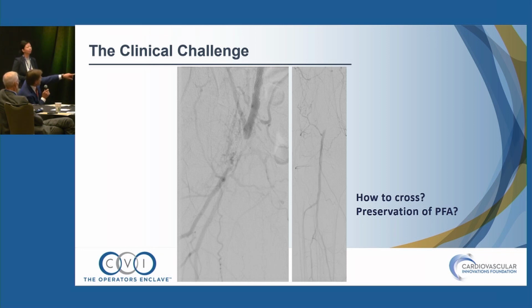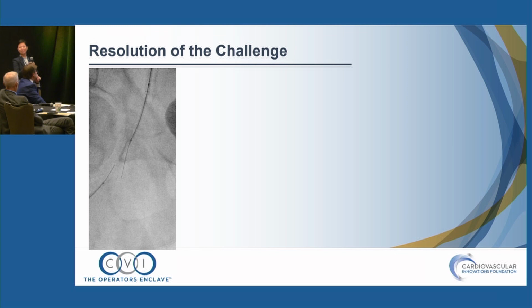I would start by going across the other way. I would have the leg prepped from below because you could always go retrograde if you needed to. But whatever I do, I would preserve the access to that profunda. Let's say you did that and did a DCB after whatever you did; you could always come back later to fix the SFA if you didn't have to go retrograde to fix it. Great.